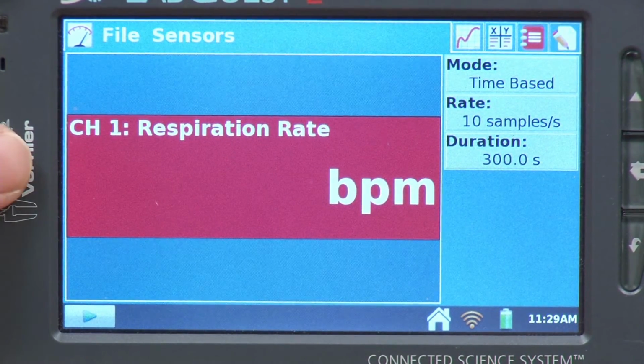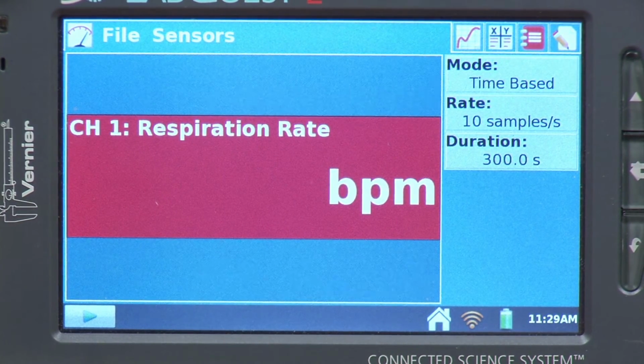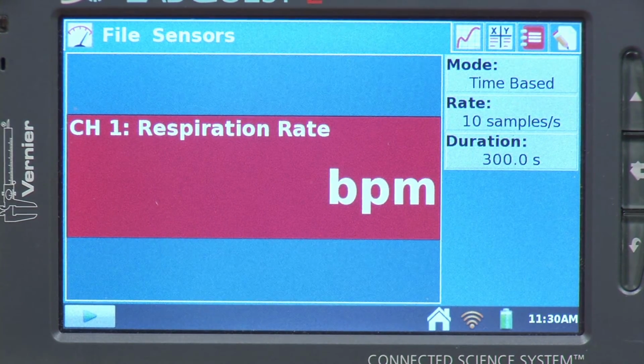And what we're seeing now is that it recognizes that it's using the respiration monitor belt, and the units here are breaths per minute. And what this does is that it actually has to calculate that value. And so it's measuring the increase in the pressure in the cuff as you breathe in and out, and essentially counting those in a period of time and calculating that value. So there will be a lag in the data that you see on the screen. Now, if you look at this up here, it says duration 300 seconds, 5 minutes. So that's the default. I will use that. And then the rate of 10 samples per second.